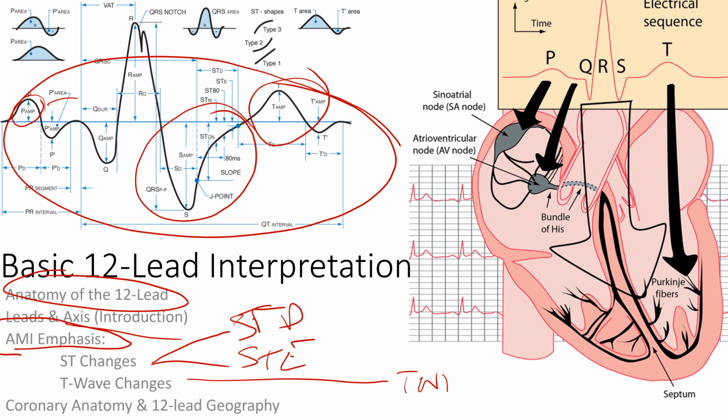All right, so that's the idea behind 12 leads, is to figure out what vessel is being occluded at this time. We're going to have an occlusive MI or an obstructive MI. It's the coronary anatomy and the geography, which leads, like II, III, aVF or I, aVL or V5, V6 or V1 through V4, which one of these patterns looks at a specific part of the heart.